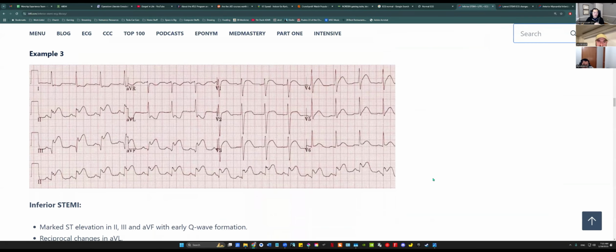Do you see this one? Okay, all right. So, walk me through this, you guys. Talk me through. In V1, right there, am I looking at anything that's reciprocated in 1, 2, 3, and 4, or is that normal? I'm probably not seeing anything.